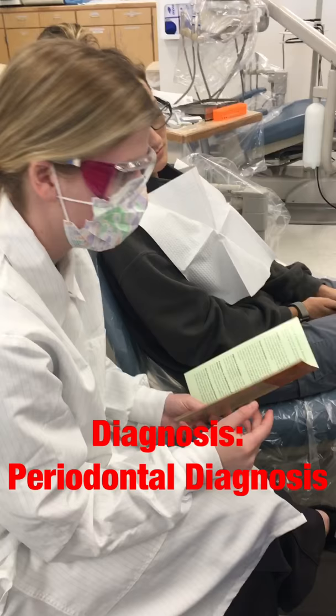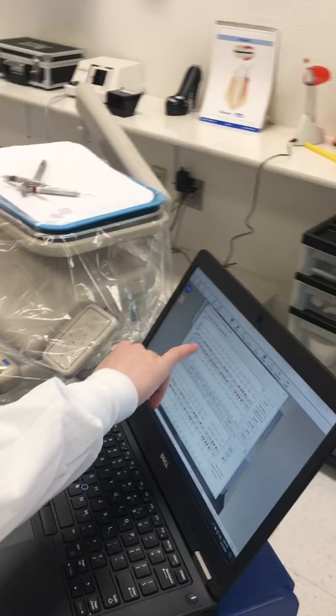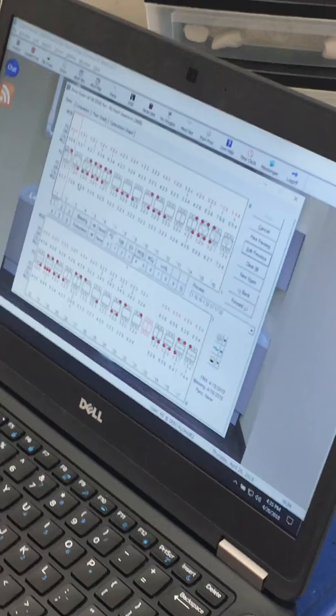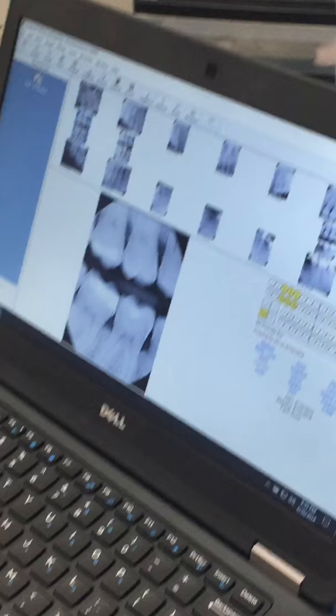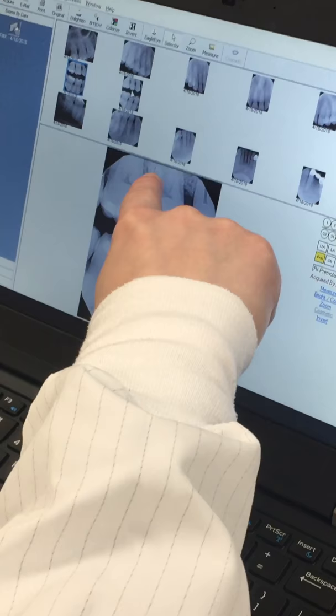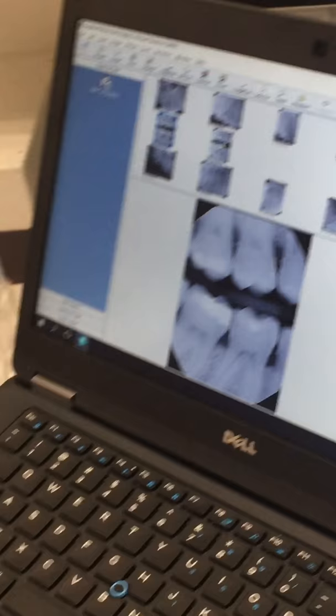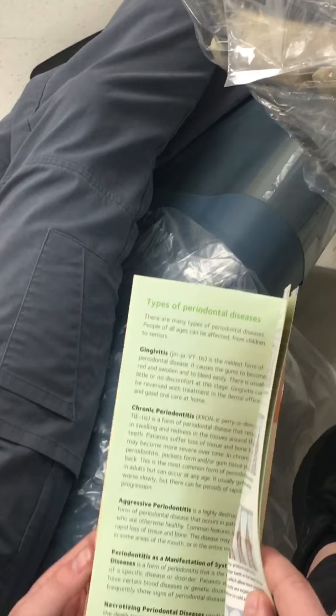Looking at your probe readings, since there are some sixes and some fives with some bleeding, we know that there's infection and bone loss. When we look at your x-rays, this is where your normal bone is supposed to be and now it's progressed to there, so you do have some bone loss. I would say that you are at slight periodontal disease, which is case type 2, so we want to try and get that under control for you.